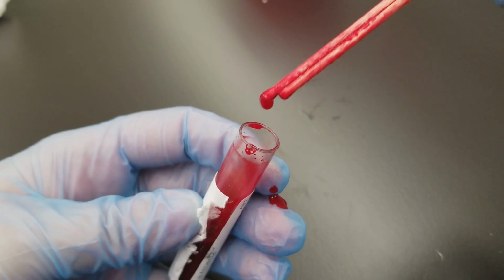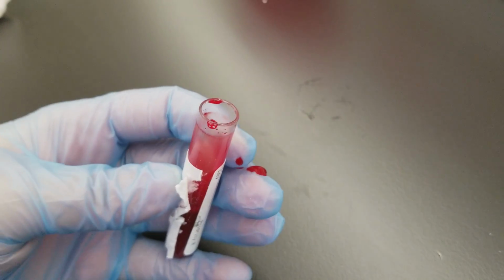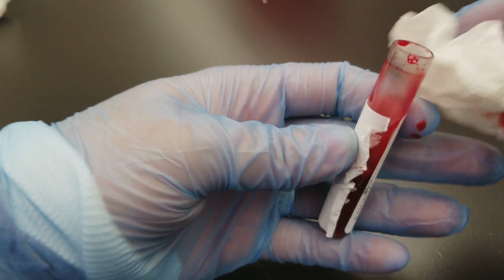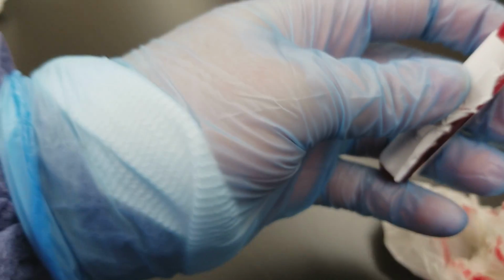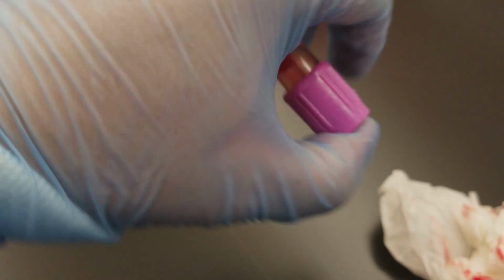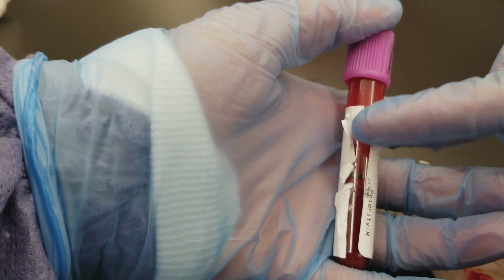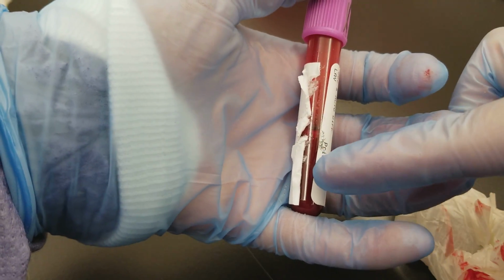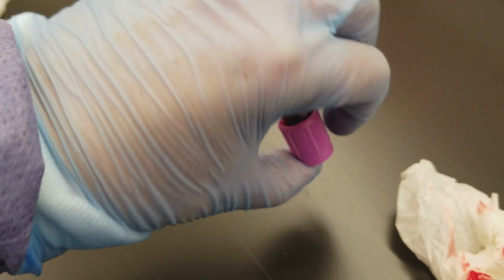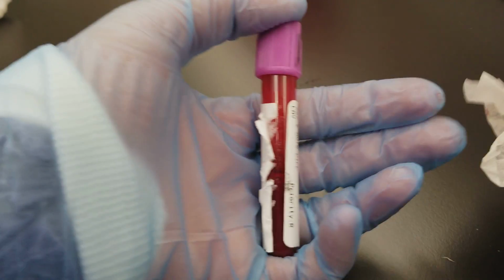You can also feel a clot in a specimen by placing the top of the tube on there. And when you're initially rocking, if it's a large clot, it'll feel clunky, like it feels like it's rolling to the end, and you can feel it go clunk. And then it would roll to the other end and you feel it go clunk whenever you're gently rocking it like this.